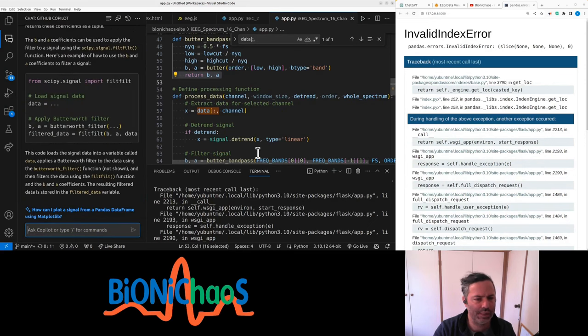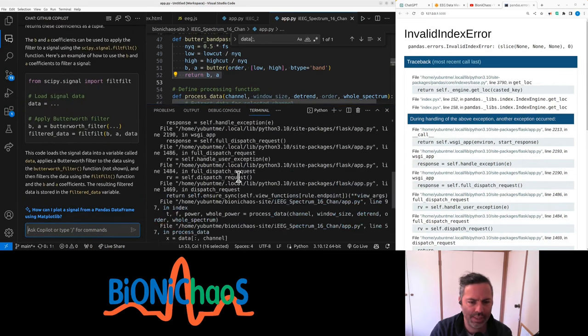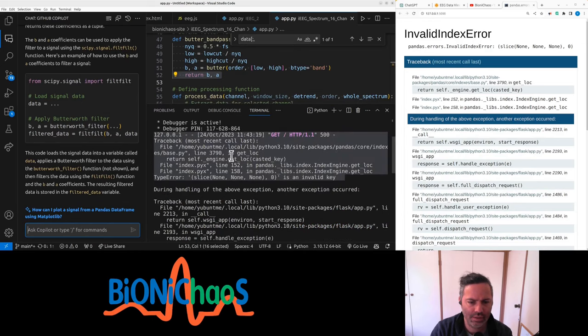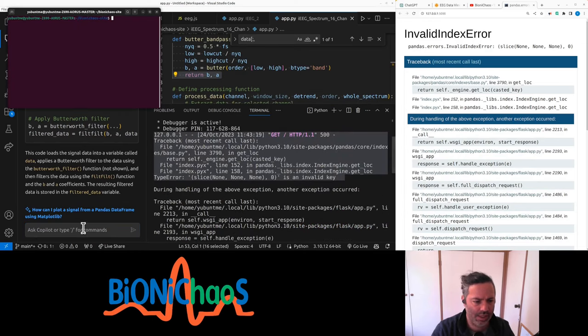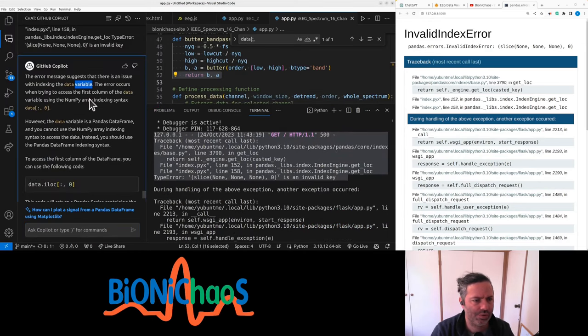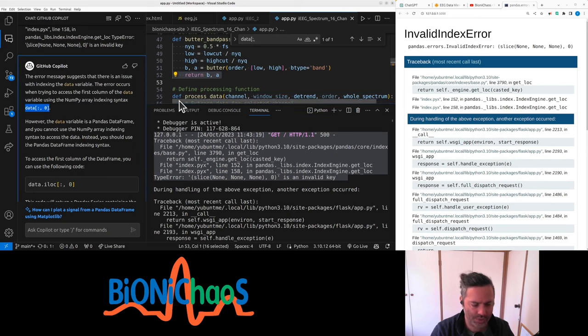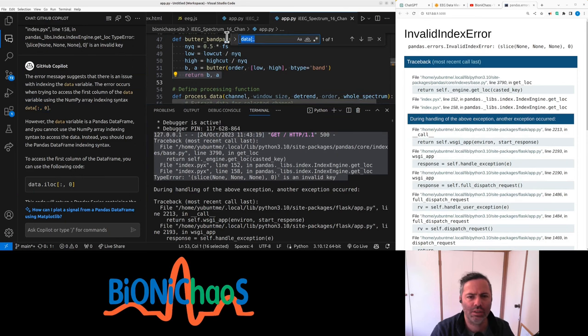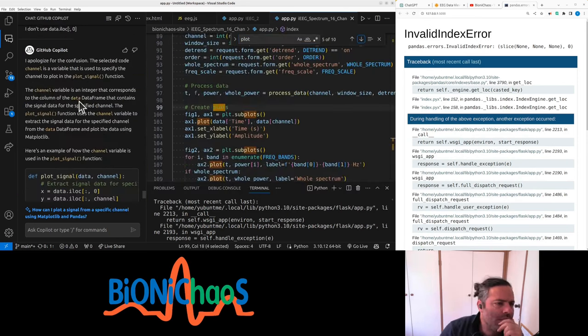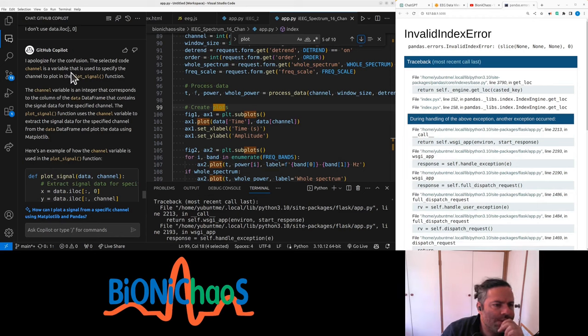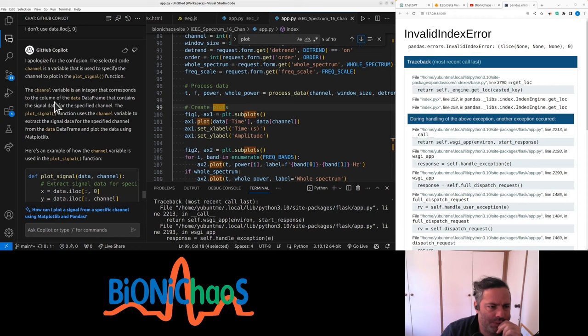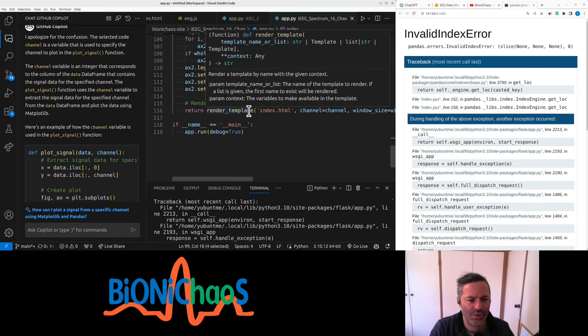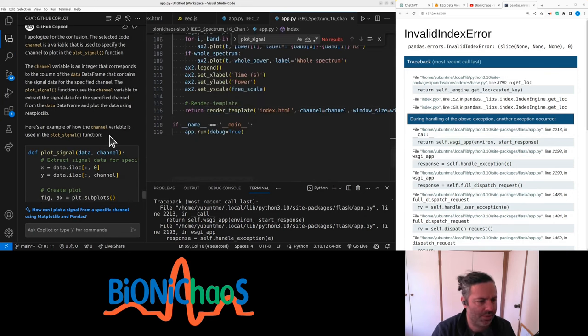I get that, but I meant with the error. To access the first column of the data, but I'm not, well not anymore. So why is it not getting updated? Select code: channel variable that is used to specify the channel to plot, signifying the channel variable is an integer. Content signal, the plot signal function to extract the signal data from specified channel. What is it talking about? There is no - it's like getting it to clear the chat or something.